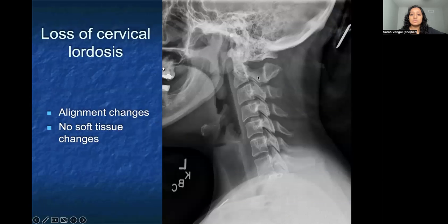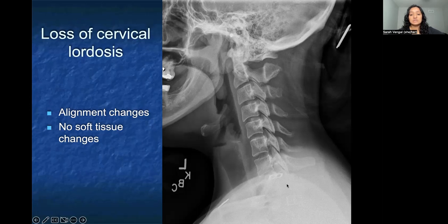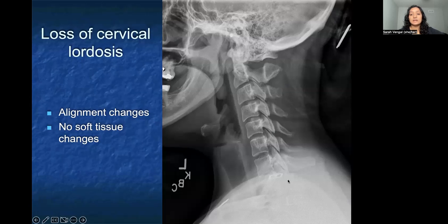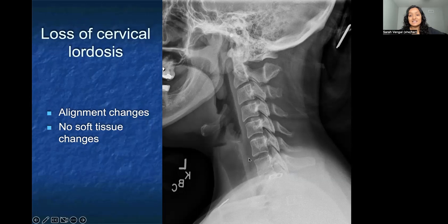When we talk about loss of cervical lordosis, looking at the alignment of the vertebral bodies in the anterior, middle, and posterior columns, you can see everything is very straight as opposed to having a normal curvature. This can be due to a variety of reasons: patient positioning, extremely spasmed muscles causing the patient to hold their neck straight to protect it because of pain, or the patient being in a cervical collar, or having an infection like discitis or osteomyelitis. In this particular x-ray, there is no anterior soft tissue swelling, so this is less likely to be an infection and more likely secondary to positioning or muscle spasm.